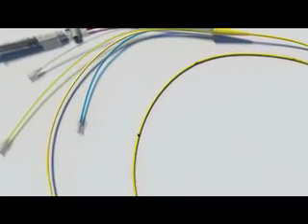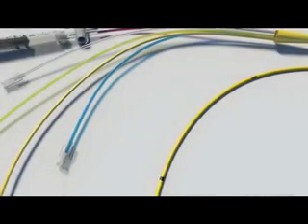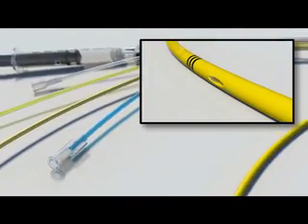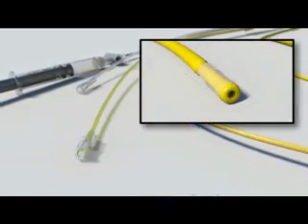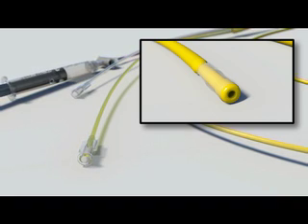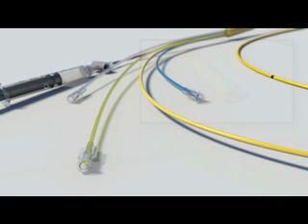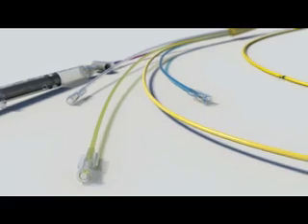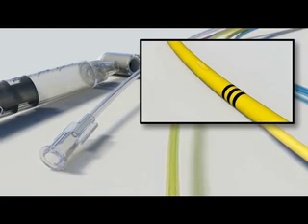The marks along the catheter indicate the distance from the tip. Thin marks indicate 10 centimeters, and thick marks indicate 50 centimeters. A proximal port, usually blue, connects to a lumen 30 centimeters from the catheter tip and is used to transduce right atrial pressures once the catheter is in its final position. A distal port, usually yellow, connects to the catheter tip and is used to transduce all pressures during catheter insertion or pulmonary artery pressures once the catheter is in its final position. Some catheters contain an additional port, usually clear or white, that connects to a second lumen 30 centimeters from the catheter tip and may be used for infusions.